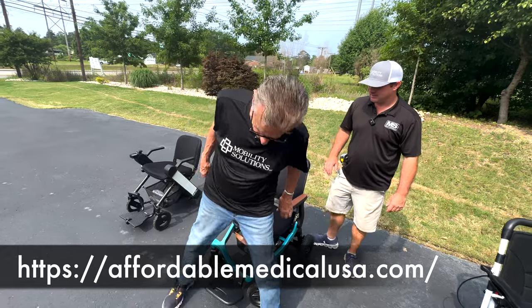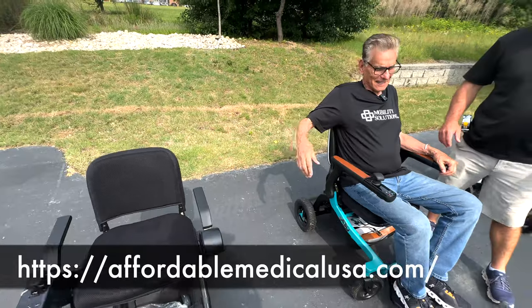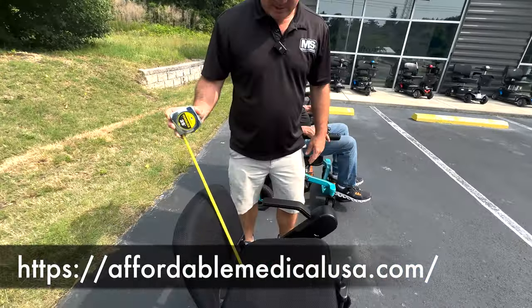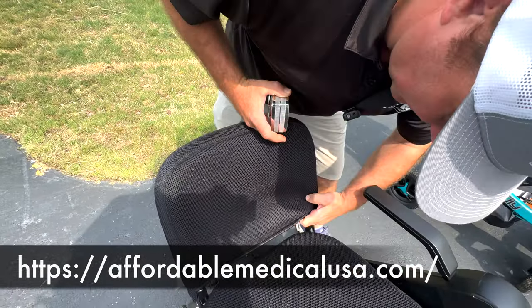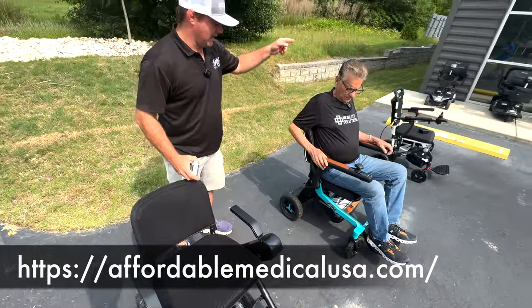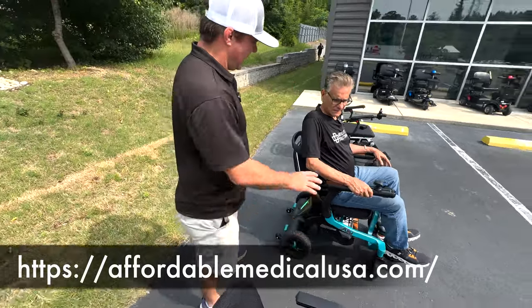An 8? Oh, no, this is an 8. No, that one's a 7. A 7? Yeah. This one has a higher back. Check out the back, it's higher on this. The back is about 14 inches from the seat. And I don't think you can adjust that. You can't. This does have a removable seat cushion, as does that one and that one. All right, so you gave this a 7? Yeah. And then this one an 8?